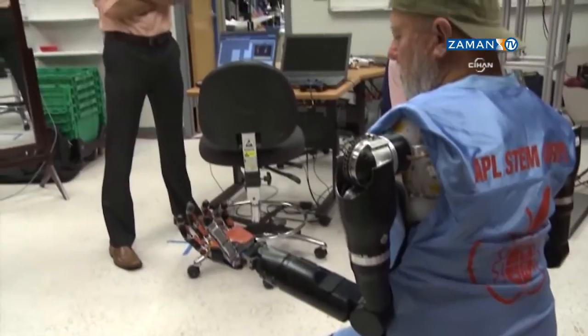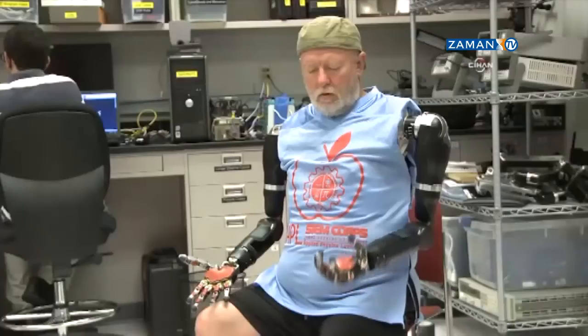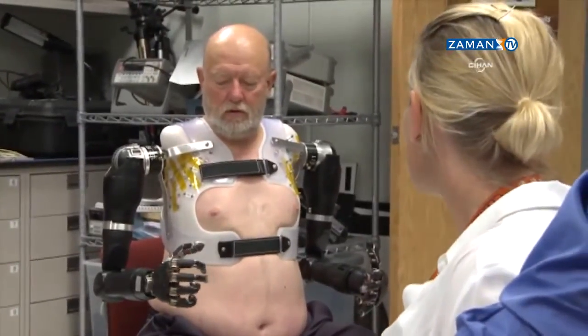I think we're just getting started at this point. It's like the early days of the Internet. There's just a tremendous amount of potential ahead of us. He has access to all of the different degrees of motion — shoulder, elbow, wrist, hand — but he still needs to select which one he wants to use.